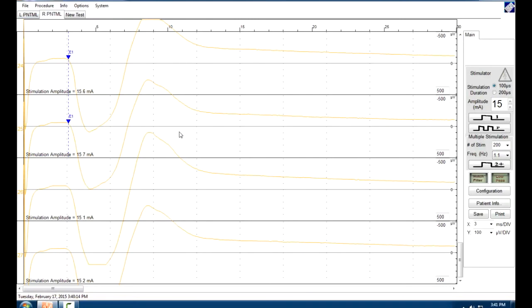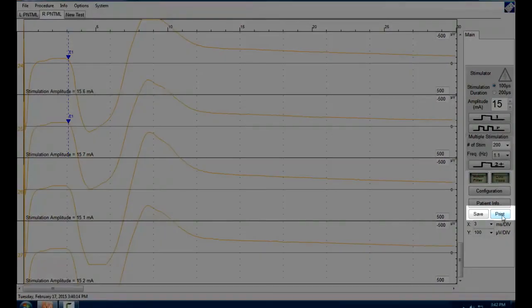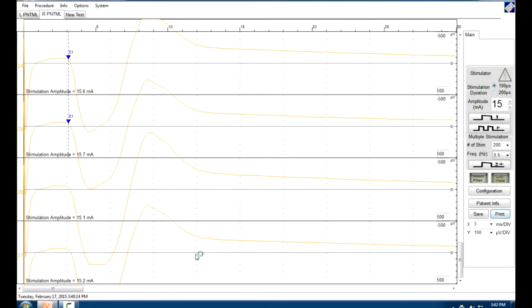You can go ahead and let the patient clean up, and then we're going to go ahead and just print it. Way over here on the far right hand side it says print, and it's literally as simple as just clicking the button. The waveforms that it's going to print are only going to be the ones that you have marked. Even though we've got close to 100 different waveforms, we're only going to see the ones that actually have the event markers posted on them. Once you've printed, you're done. It's simply that easy to do.